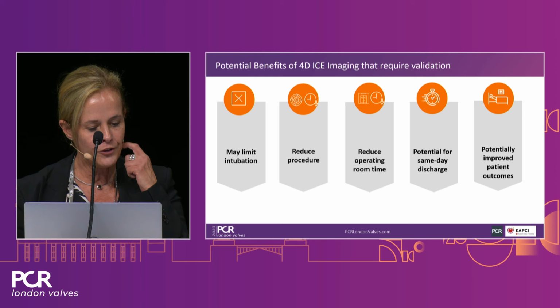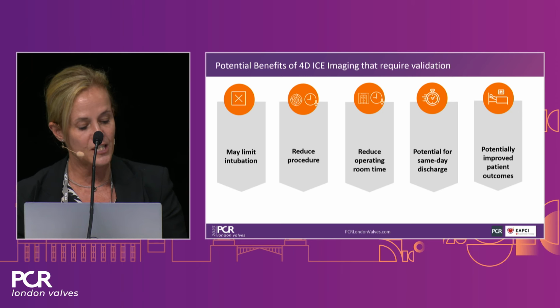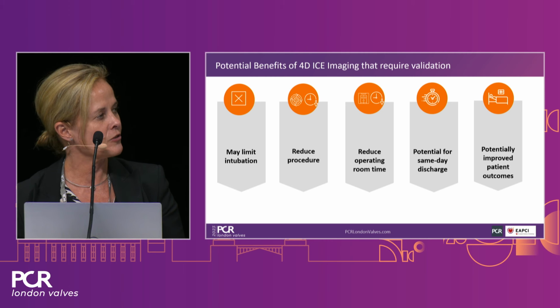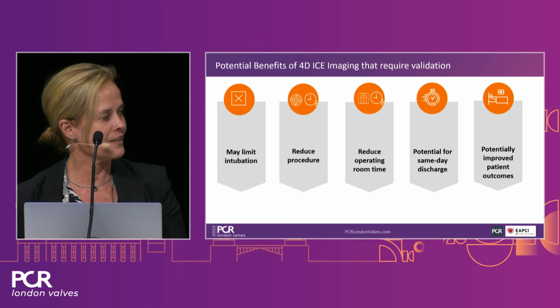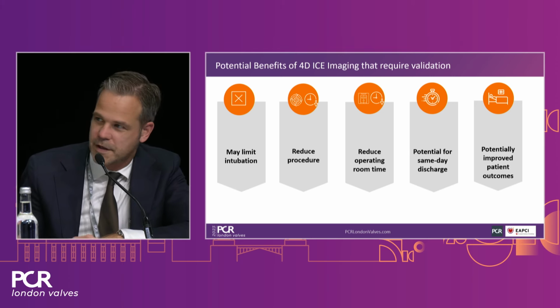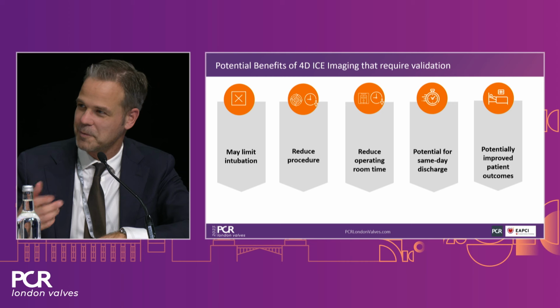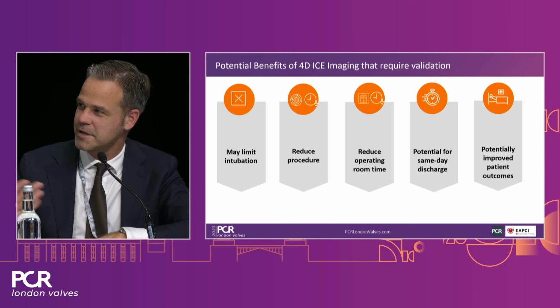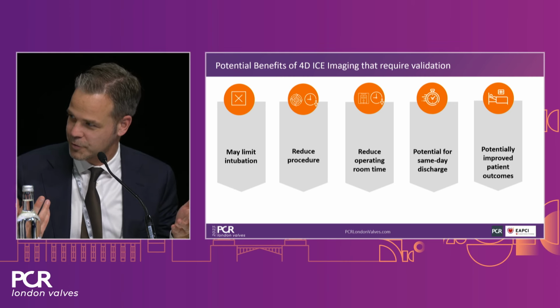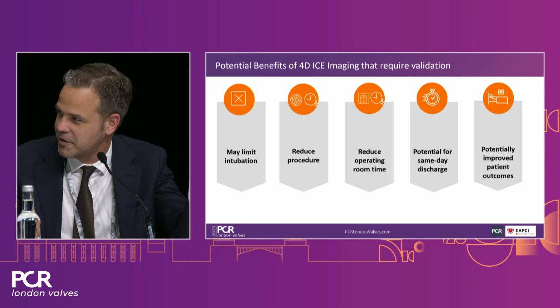So to look into some future perspectives, you already touched a couple of points. For example, Martin, the learning curve. You said this is quite easy to obtain. So how many procedures do you need to really get familiar with this new technique? I think, as Stefan already nicely pointed out, the 4D gives you so much overview. This is a view you already knew from your 3D TEE. So if you used to do 3D TEE for this kind of procedure, I think you can easily adapt. It's more getting used to the knobs than getting used to the views. As we said, we use the MPRs, we rotate it in the same orientation, and you're good to go.